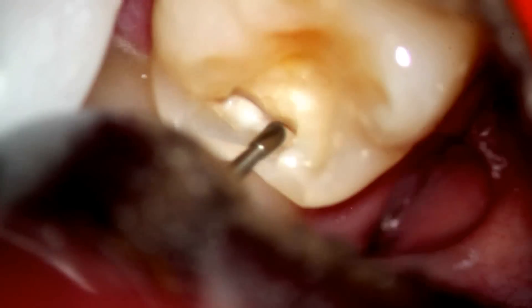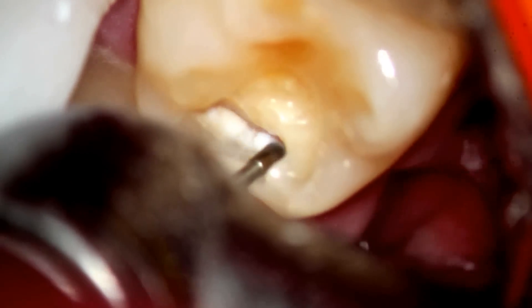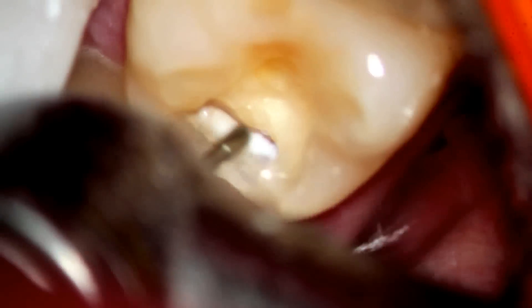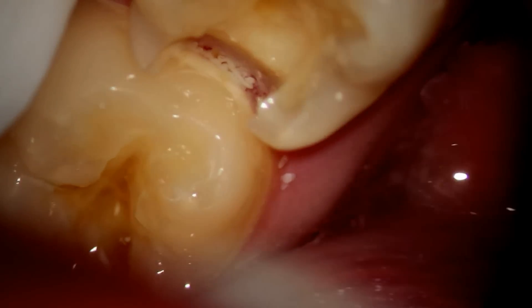The reason we did go ahead and do it was this interproximal decay that's very obvious with the white filling there — not filling, but decalcification that goes in between the teeth. If you notice, it is a broad approach all the way there. And the adjacent tooth also has decay.